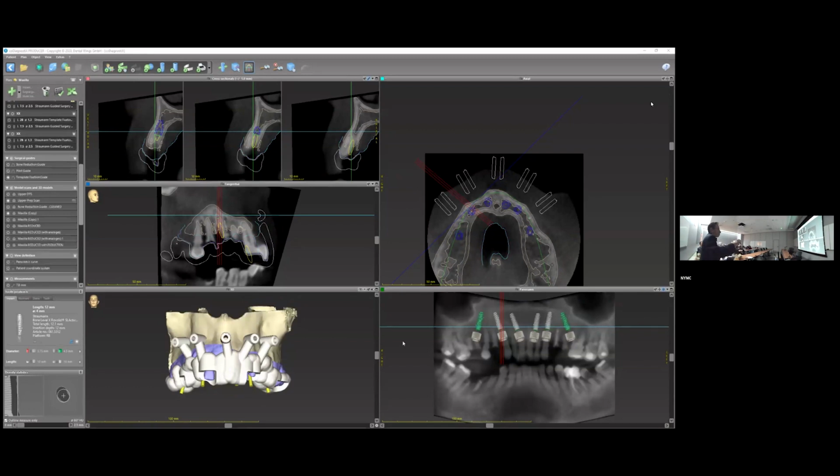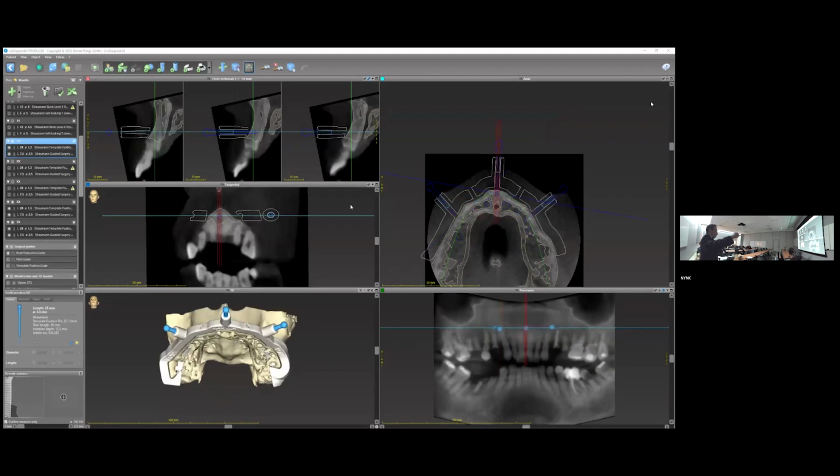So what we're going to do is we're going to make a first jig, and this is called stackable. So we make a first jig, and we have these 5 holes here, and these are the teeth. So this is going to sit on our teeth, and we're going to drill the holes into the bone. We are then going to take that jig off. We're going to put another jig on, and that's going to mount into 3 of those holes that we previously drilled. So now it's exactly matched.